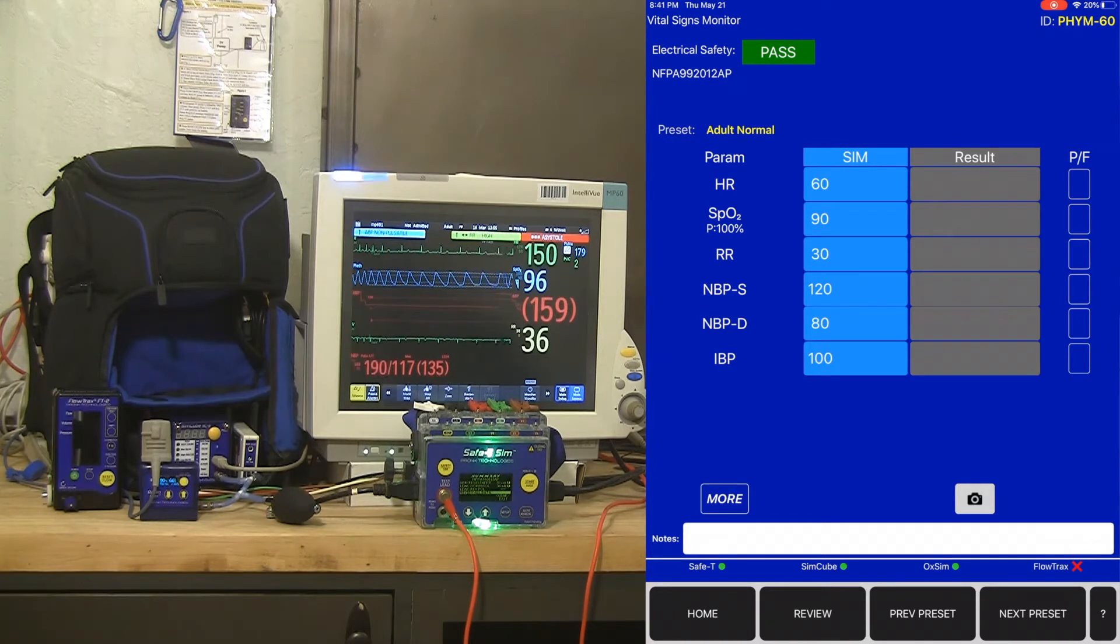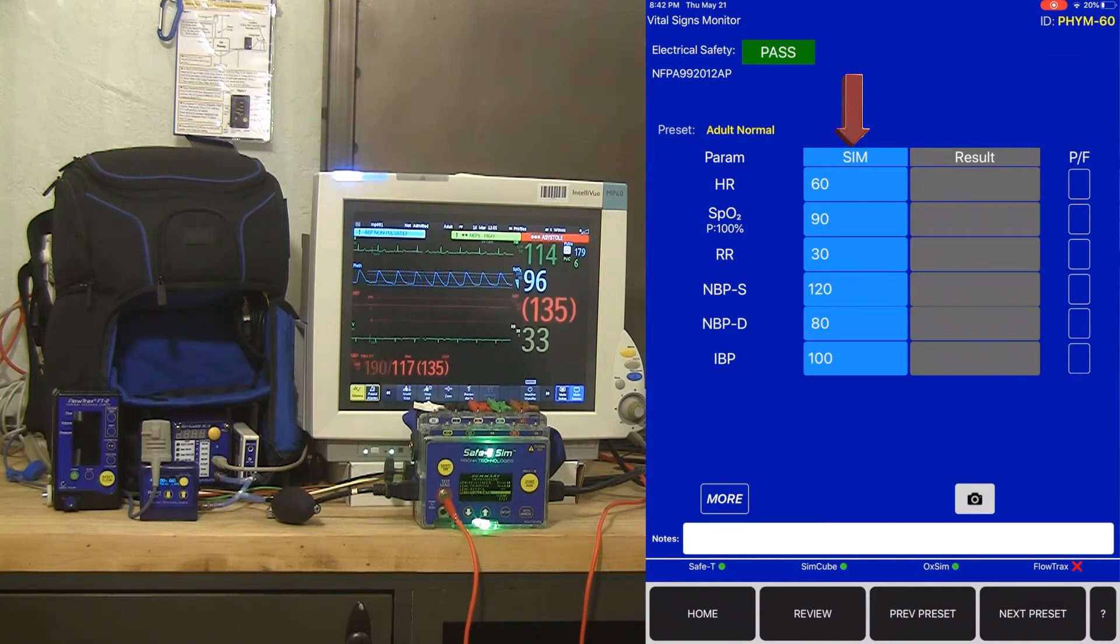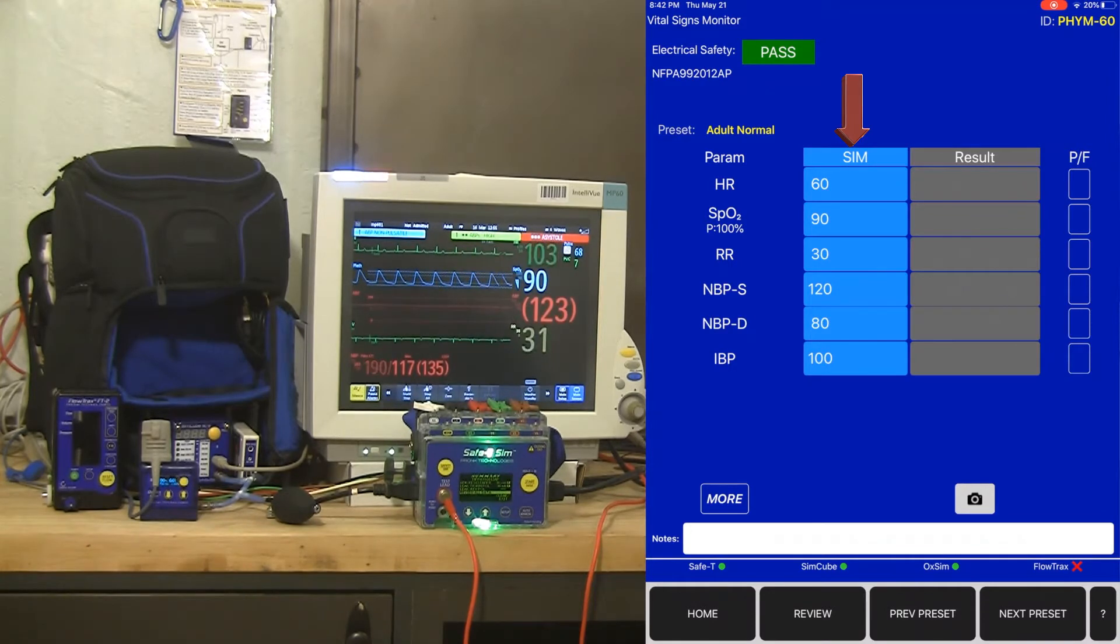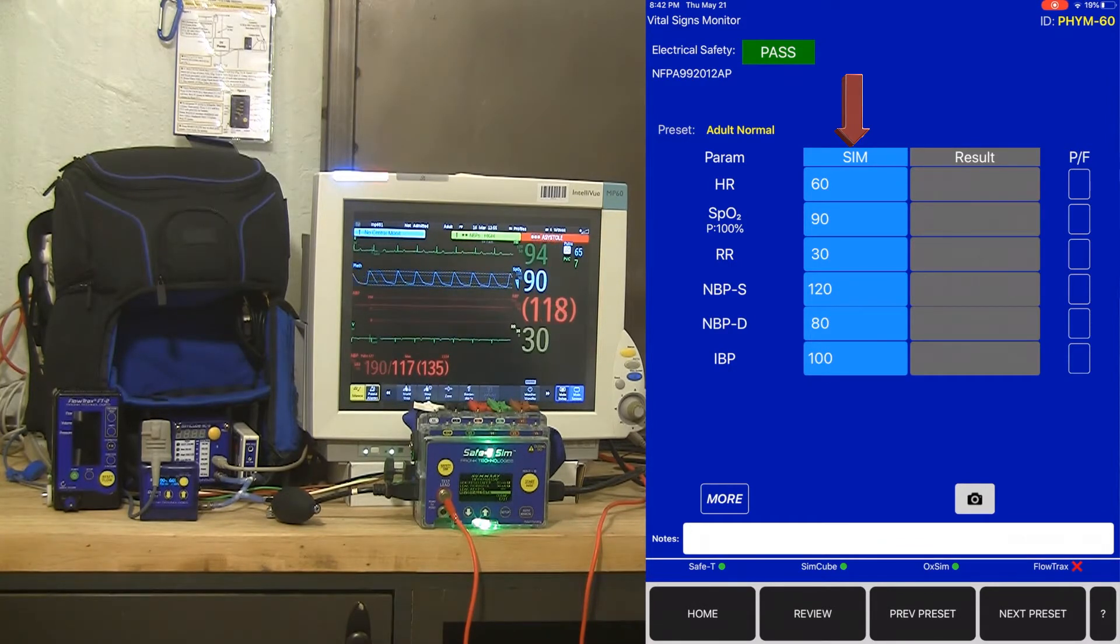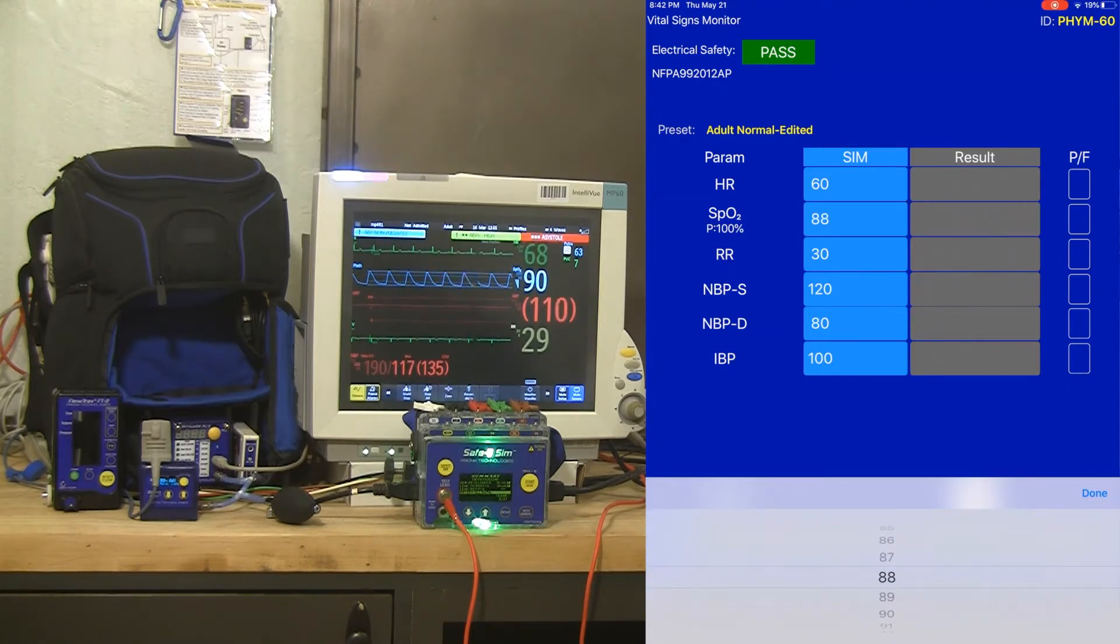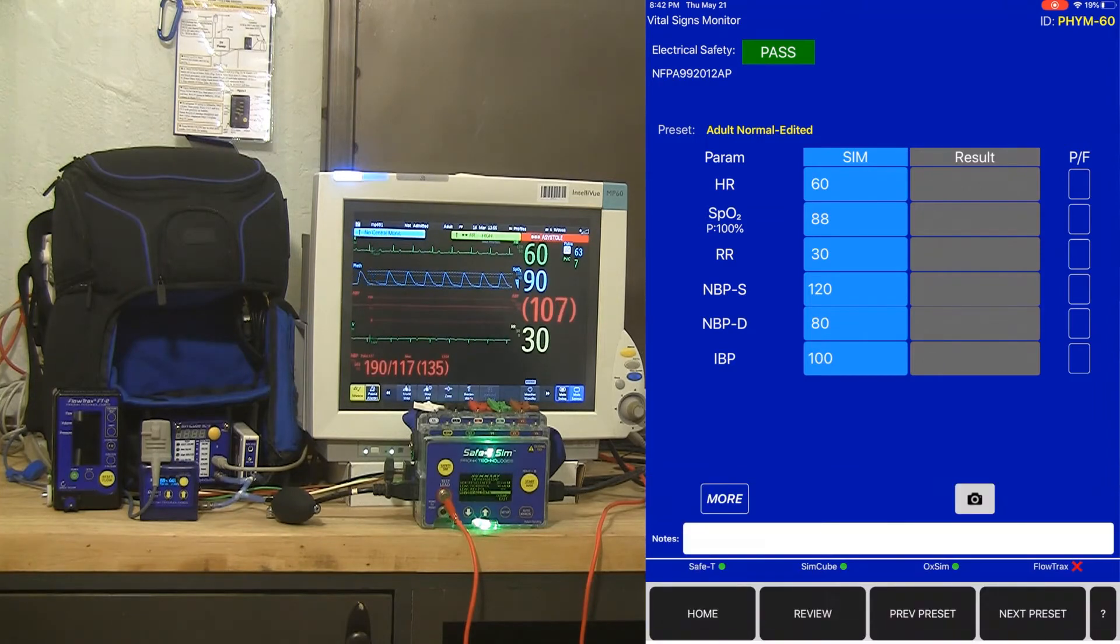Be aware that you don't have to stick with the simulated values on the left-hand column. If you need to adjust those based on a manufacturer requirement, let's say that SPO2 requirement is 88 instead of 90, you can actually change that simulated value. You're not stuck with it and you can customize as you go.